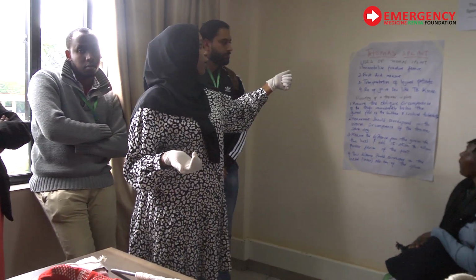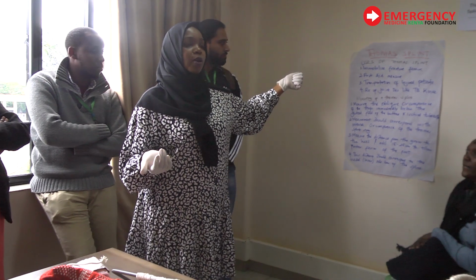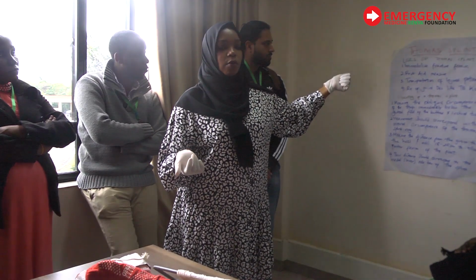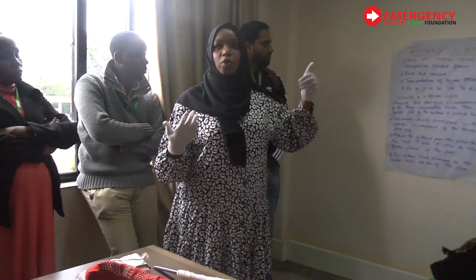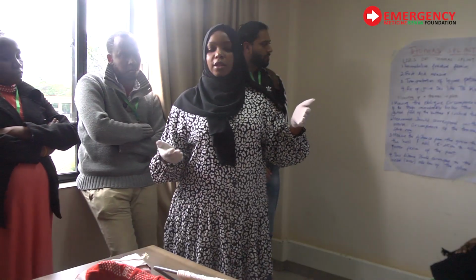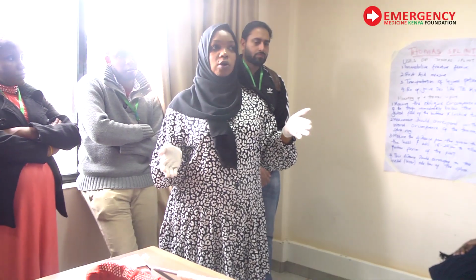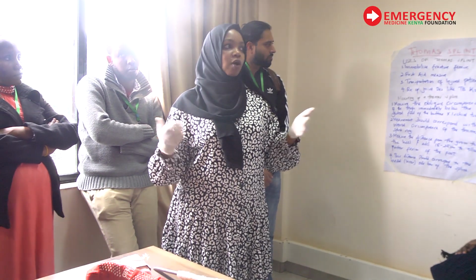The other thing is as a first aid measure. So you've been called in a home and a lady has fallen down and you've come in, you're like, oh, this is a fracture femur from your clinical assessment, okay? The leg is shortened and all those signs, okay? So what you do, you can put your Thomas splint as you transport the patient to a facility.